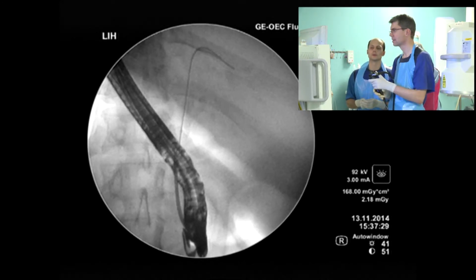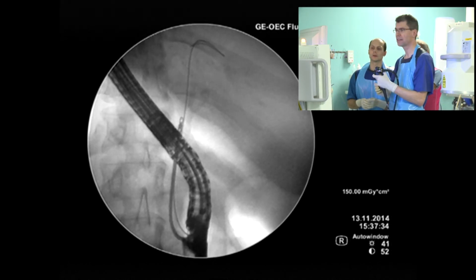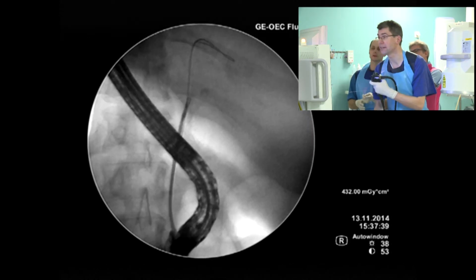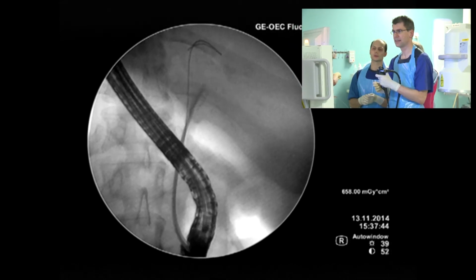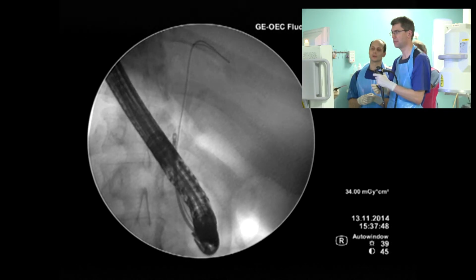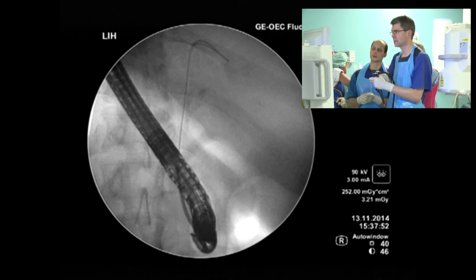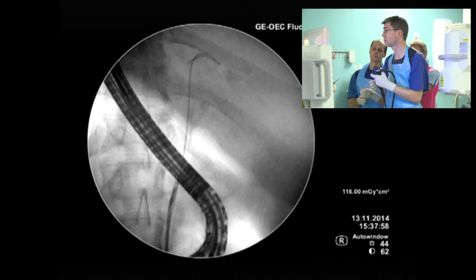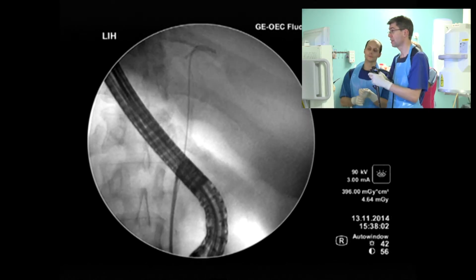Good. So now I try to advance across the cystic duct. And this. But it looks like a stricture. Yes, the cystic duct. Yeah, that's it. So what can help there is manipulating the scope a bit. Of course, tumors can also arise in the cystic duct, but my idea now was to go to the hilum, which can be difficult.